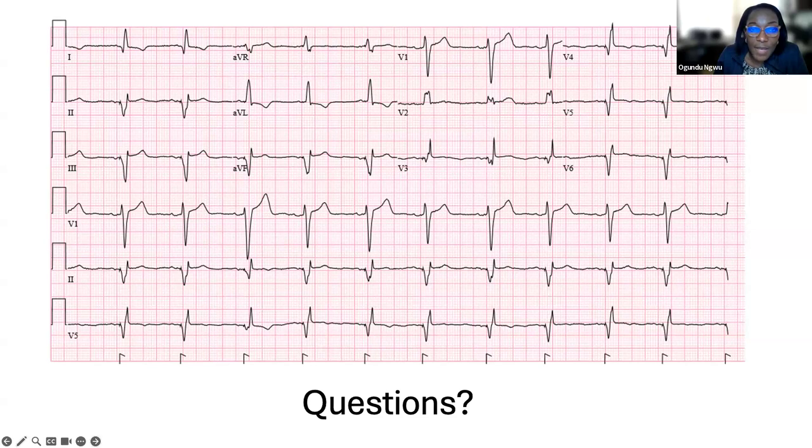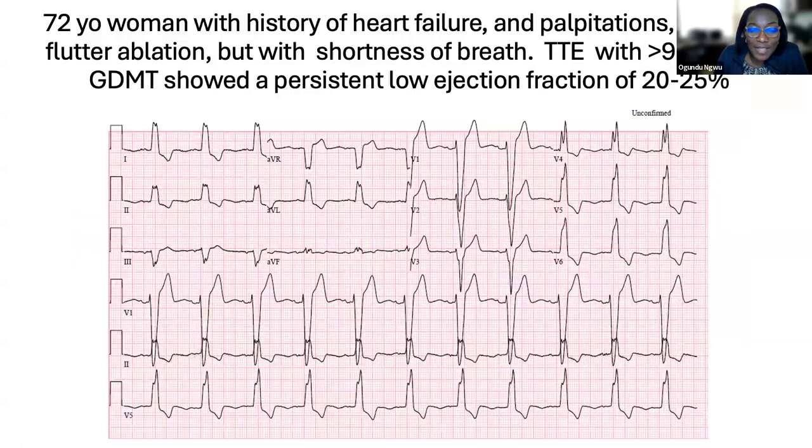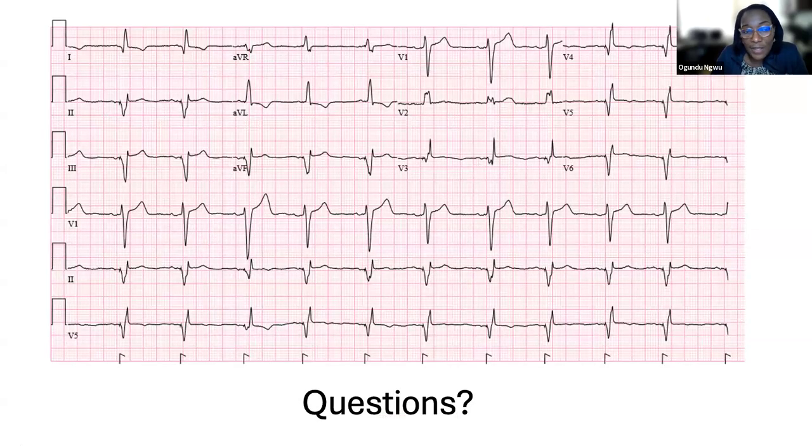And I think this may be the EKG for our first patient that we looked at with the wide QRS. I think this may be the EKG post BiV. Yeah, this was our patient at the beginning, and now they have a CRT device. And I think the important part is to continue to evaluate this patient even after the implant.